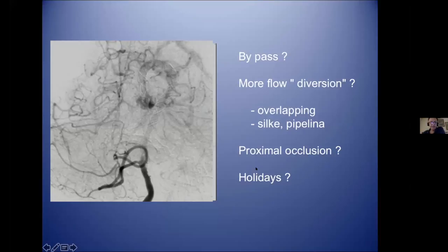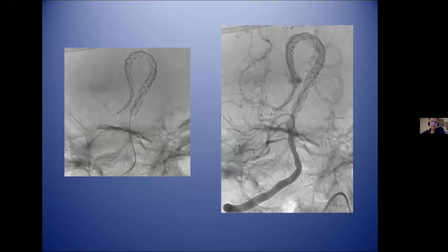I decide to treat the aneurysm with more Leo stents. I place 2 more Leo stents. Total 7 Leo stents.